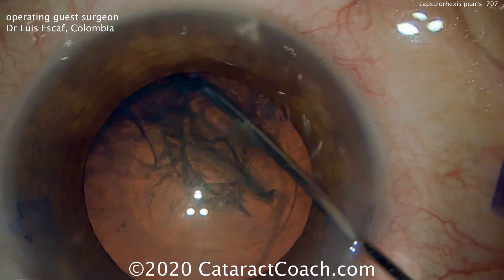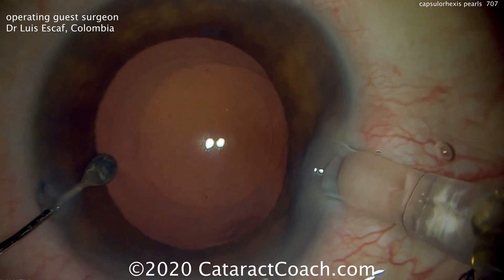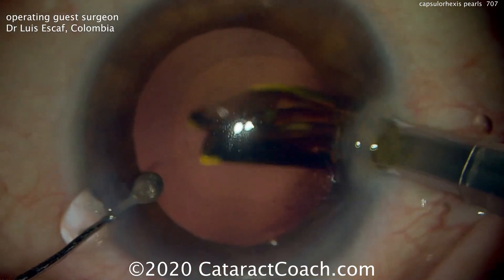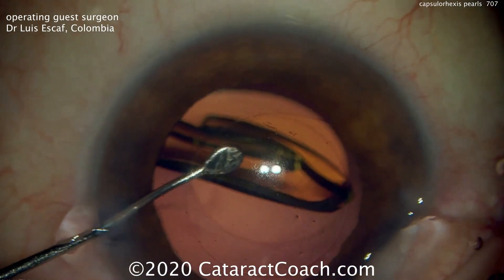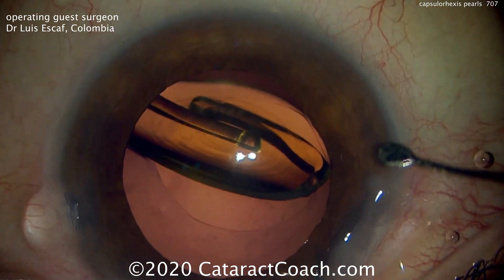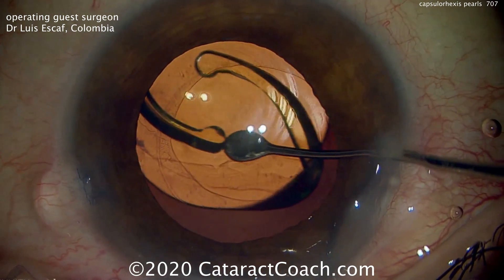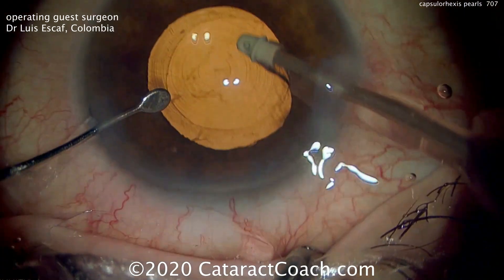The rest of the case goes normally. Here's the IOL insertion. This capsulorhexis may appear, when you first glance at it, to be a little decentered, but it's actually perfectly centered. Remember, you want that capsulorhexis to line up with those Purkinje images, which is very close to the visual axis of the eye — especially in this case when we have a multifocal or trifocal diffractive lens.